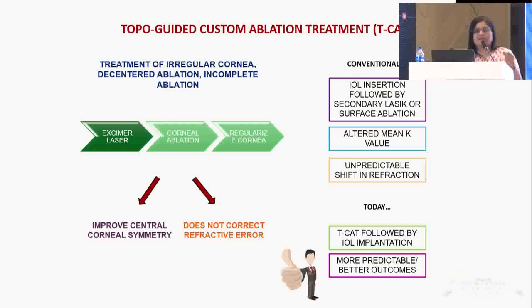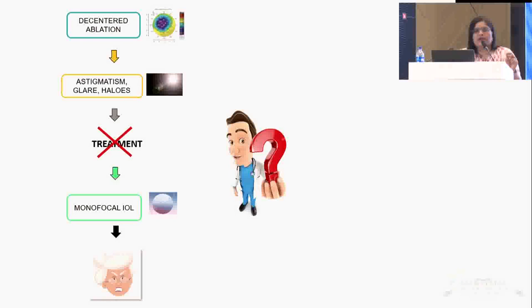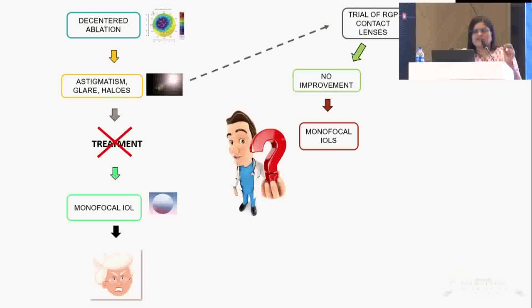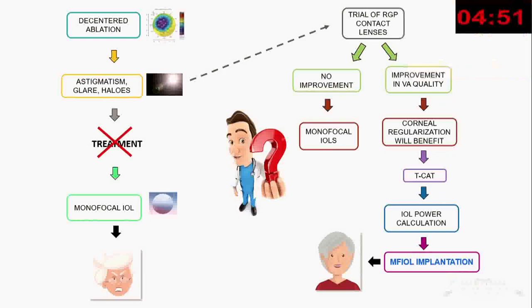Today, we do TCAT. Now, TCAT is basically like, if you have a decentered ablation, the patient is already having astigmatism, glare, and halos. Without treatment, even if you give a monofocal IOL, the patient is going to be super unhappy. What you do is, you give a trial of RGP contact lenses, and if there is no improvement, go for monofocal IOLs. But if you see that there is improvement in visual quality, if you see that corneal regularization will benefit, do a TCAT, do the IOL power calculation, and then you can even go for a multifocal diffractive IOL implantation with this.